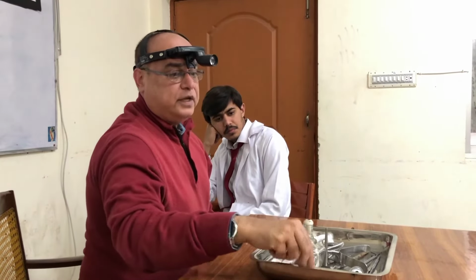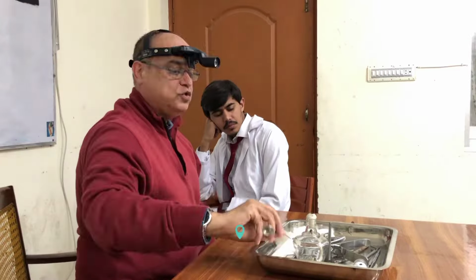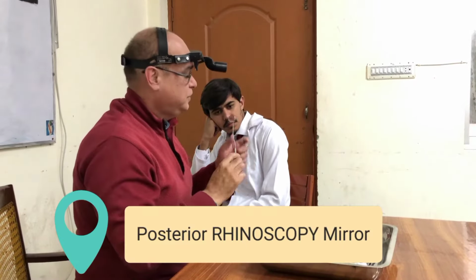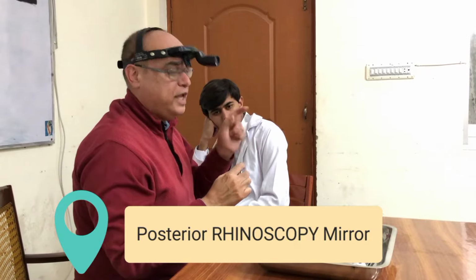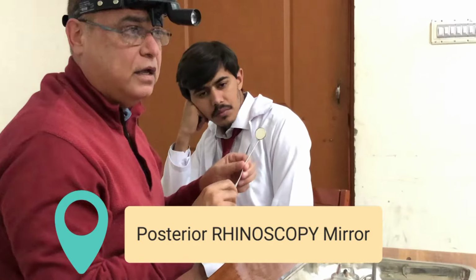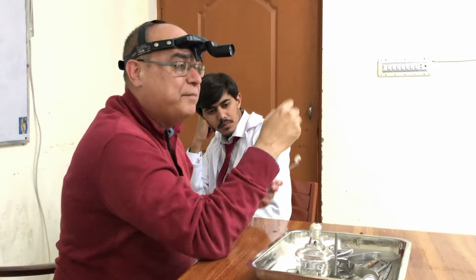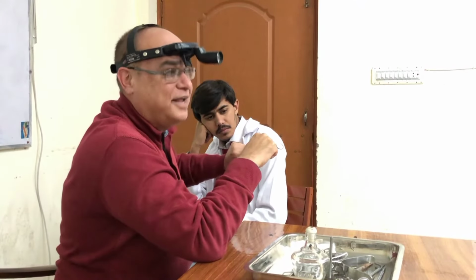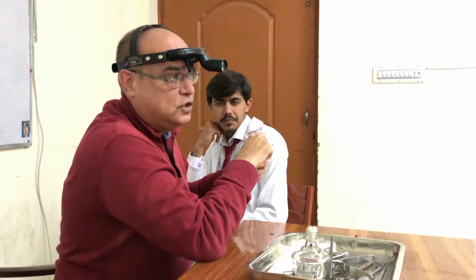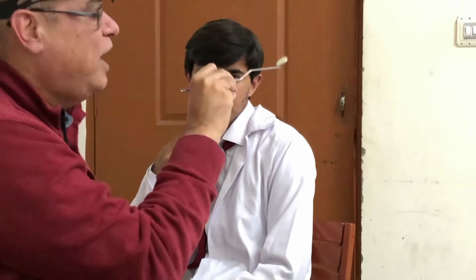Now, posterior rhinoscopy, we cannot visualize directly. So we have to use a mirror. You can see this is a mirror, and it has a step here. Why is this step there? In laryngeal examination, we use a mirror which has a straight limb, with no step. Here it is a step because we have to look upwards and hold it.